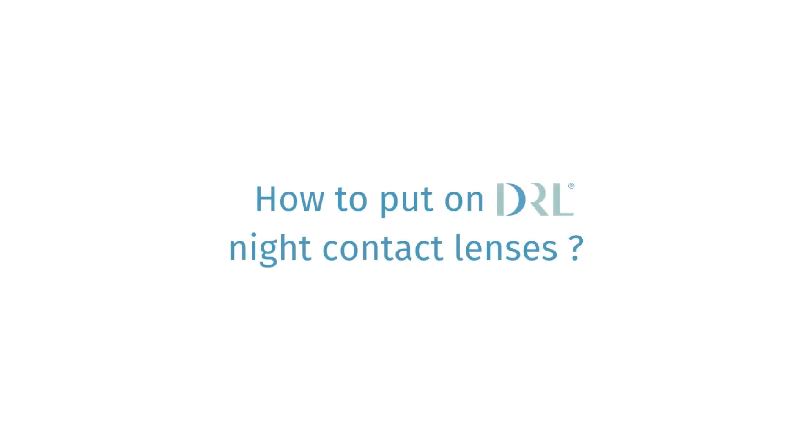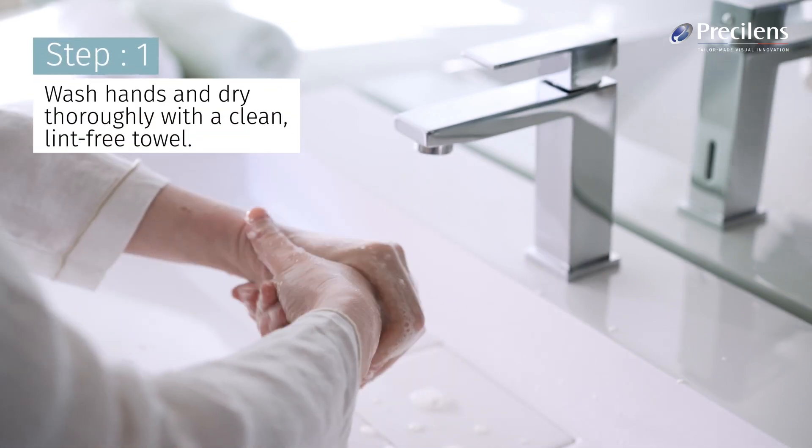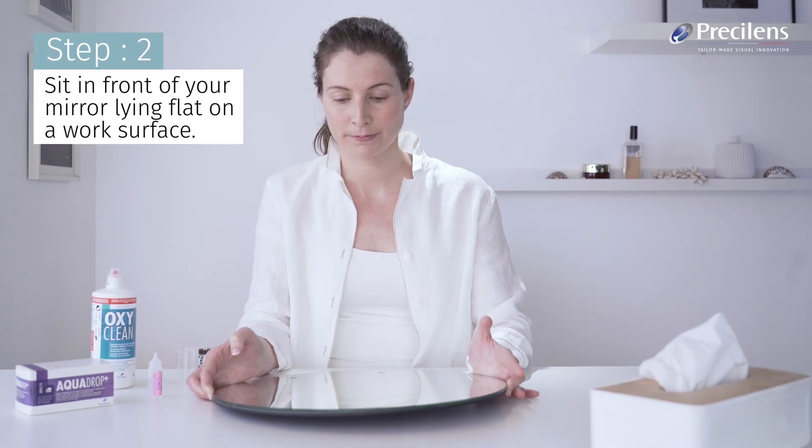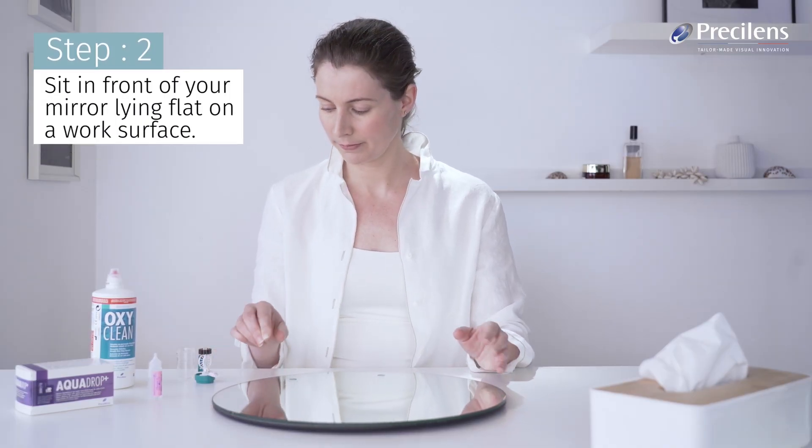How to Fit Your Lenses Safely at Night. Wash hands and dry thoroughly with a clean, lint-free towel. Sit in front of your mirror, lying flat on a work surface.